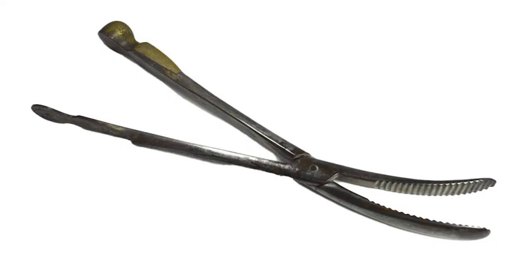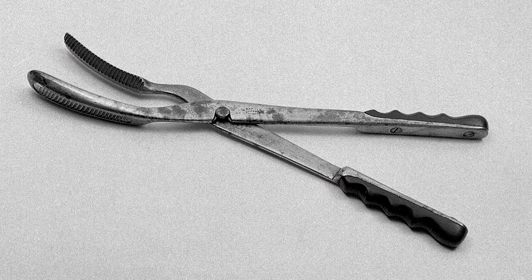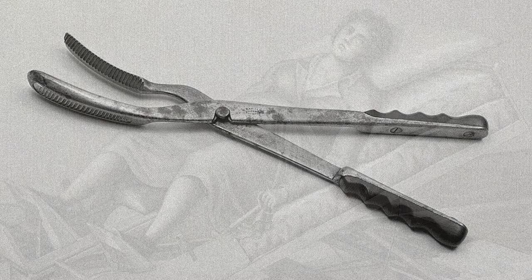Cranioclasts are forceps-like surgical instruments designed to extract the body of a dead fetus following an unsuccessful delivery. Although similar ideas have been discussed in ancient Greek, Roman, and Arabic texts, Cranioclasts were invented in the mid-19th century when difficult births often resulted in the death of both mother and fetus.